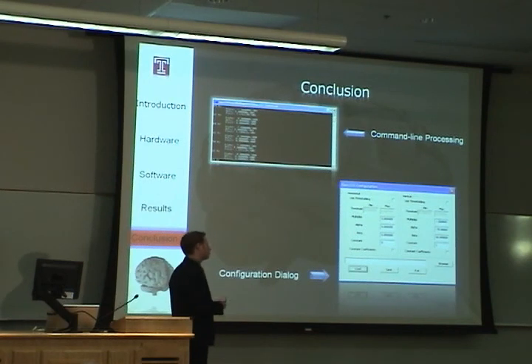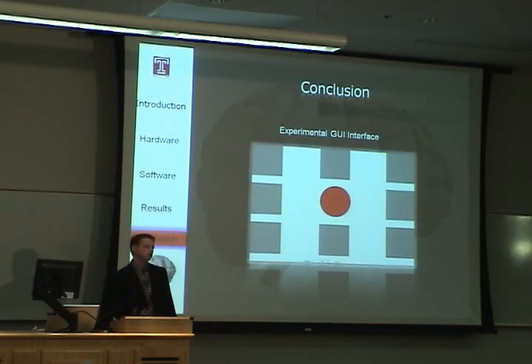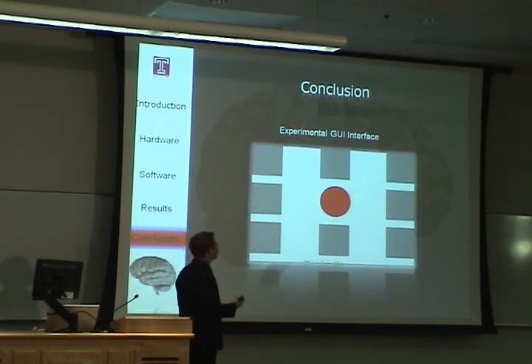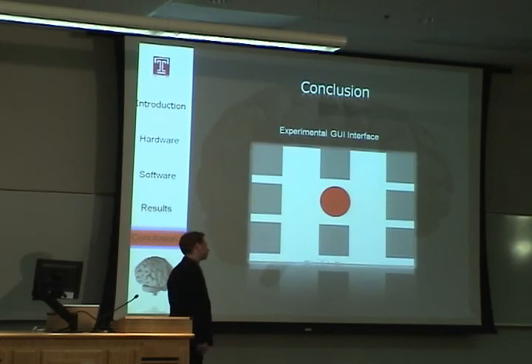But we have also included this graphical interface for tweaking, and it's been especially helpful in our lab experiments. We did some experimental GUI interfaces for calibration routines that we originally proposed. I don't know if any of you saw that presentation, but there are a lot of different concepts for visually walking the user through almost like a video game in order to tweak all the values of the equations that we were using. We already designed and programmed the experimental GUI interface, but due to constraints of time, we were not able to successfully implement it with our back-end processing system.